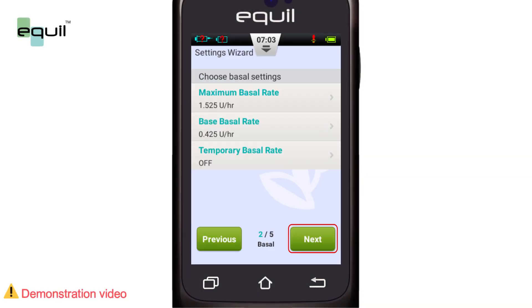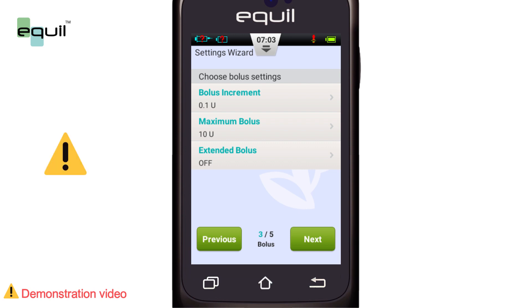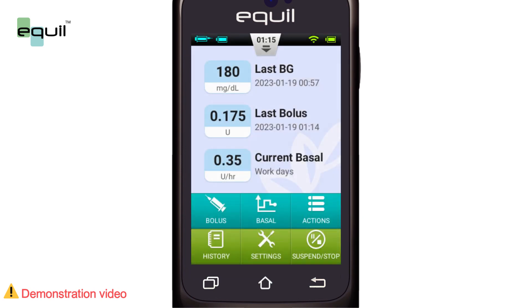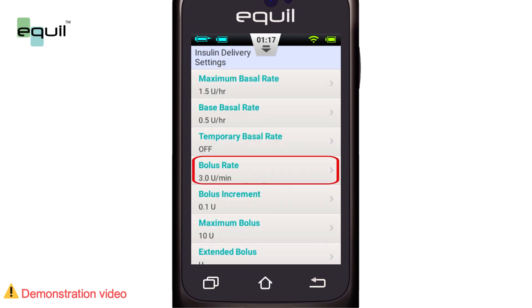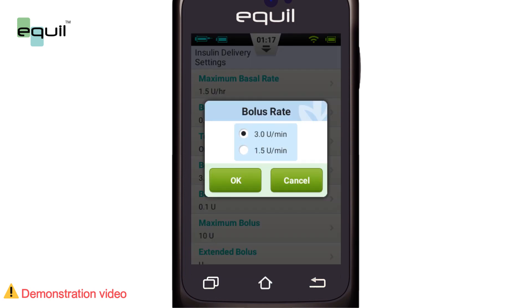At the time of pump startup, the most relevant bolus settings are made using the setting wizard in consultation with your physician. It is possible to reset them again from the home screen. Go to Settings > Insulin Delivery Settings > Bolus Rate. The normal bolus delivery rate is 3.0 units per minute. Your health care provider can use the menu to decrease the bolus rate to 1.5 units per minute.